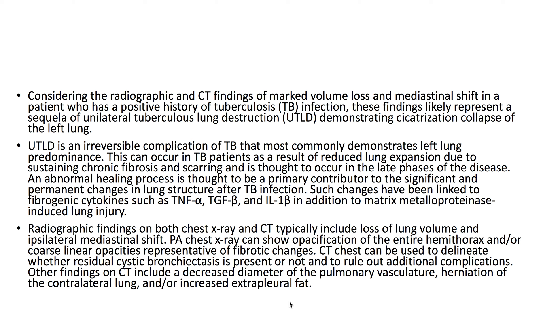UTLD is an irreversible complication of TB that most commonly demonstrates left lung predominance. This can occur in TB patients as a result of reduced lung expansion due to sustained chronic fibrosis and scarring, and is thought to occur in the late phases of the disease.